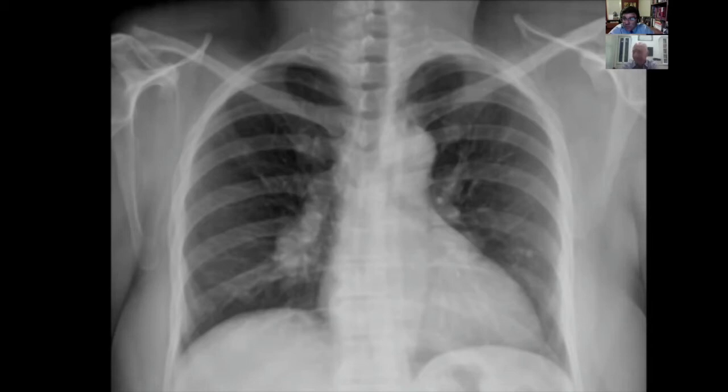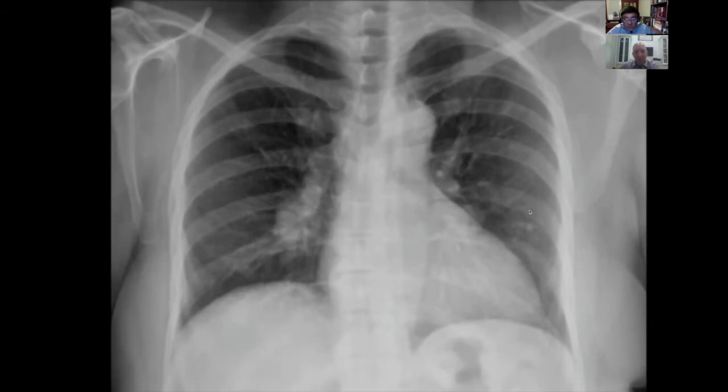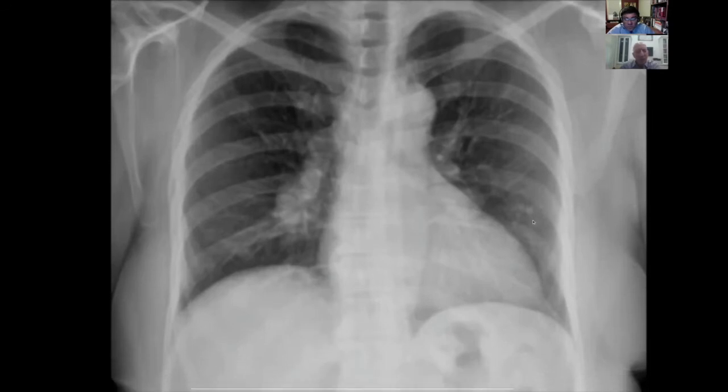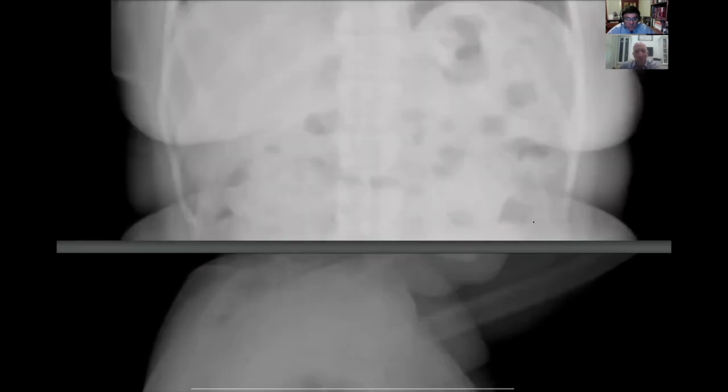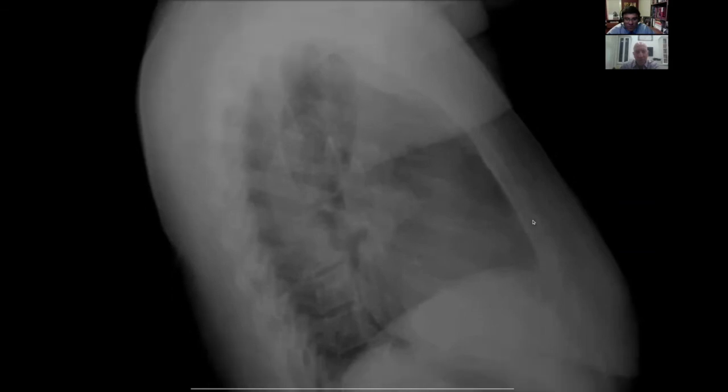Great, awesome. That's a really good pickup. Sometimes this can be super tough. I'm going to give you another view. I'm going to give you the lateral view to see if it helps you figure out whether you're looking at an enlarged vessel or if there's some node or mass there. This is the same patient, and this is the lateral view. Yeah, to me, it looks more like a perihilar mass or adenopathy than it does the vessels coming off. But you're the expert, so I'm going to defer to you.